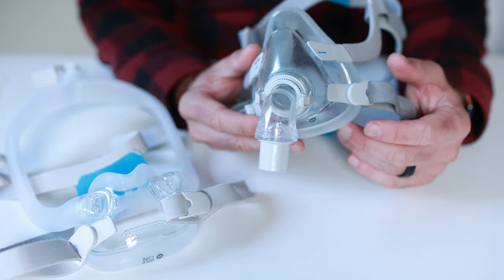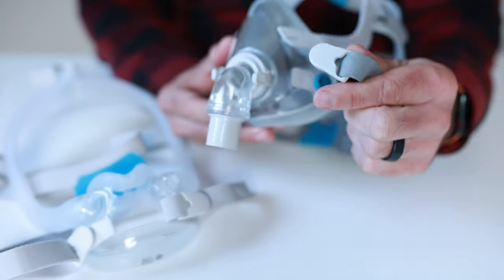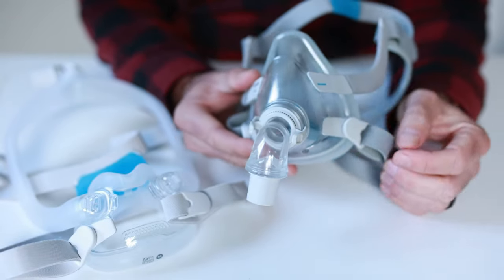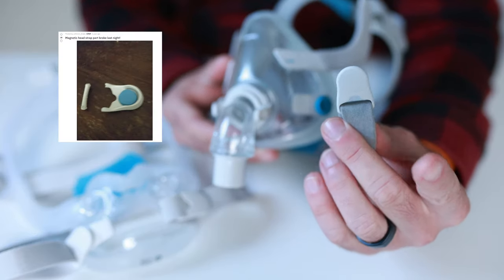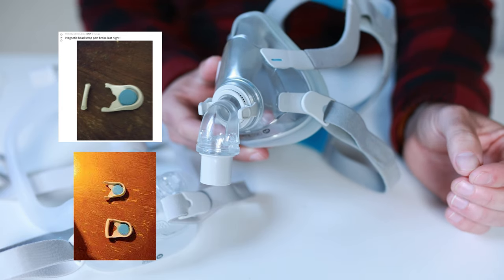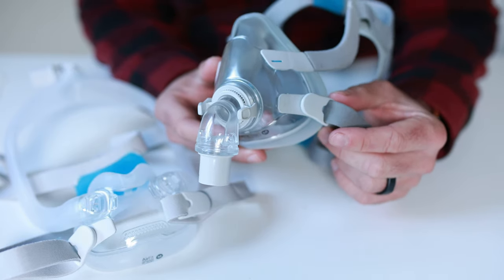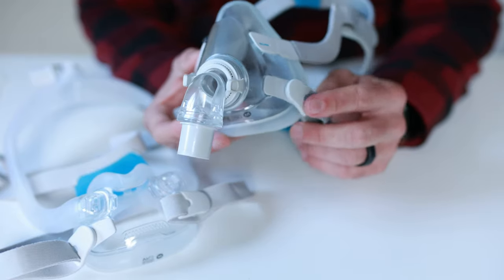A lot of ResMed masks have these great little magnetic clips which make it really easy when you're putting on and taking off your CPAP mask. However, these clips can also break. So it's great to have a set of clips in your top drawer for when that does happen. Now if you don't have a set available, I'll show you a few little hacks that'll get you through while you're waiting for your replacement clips to arrive.